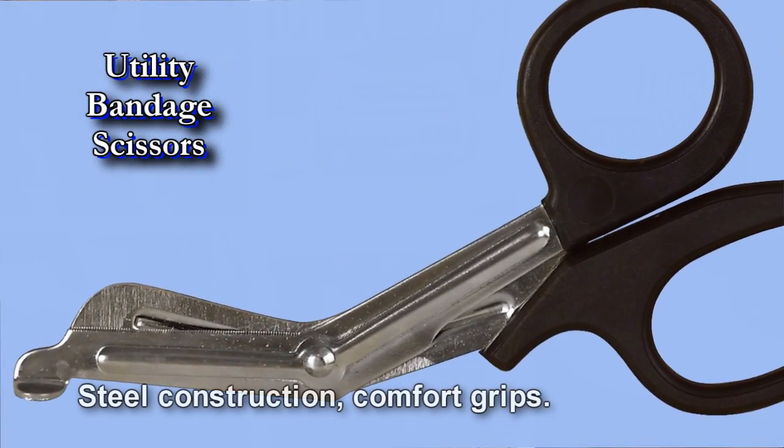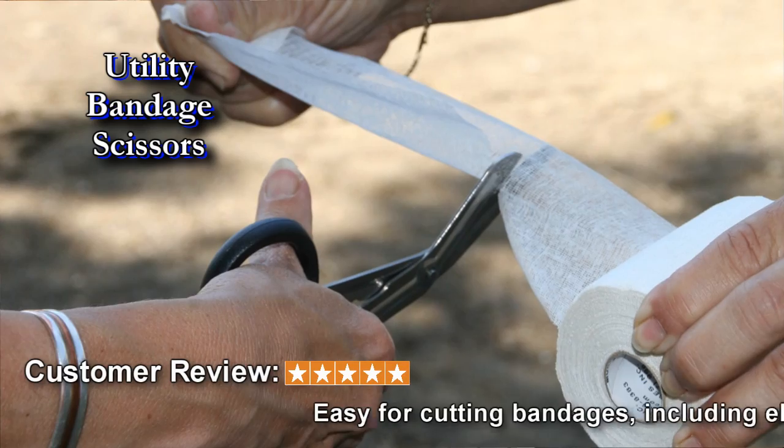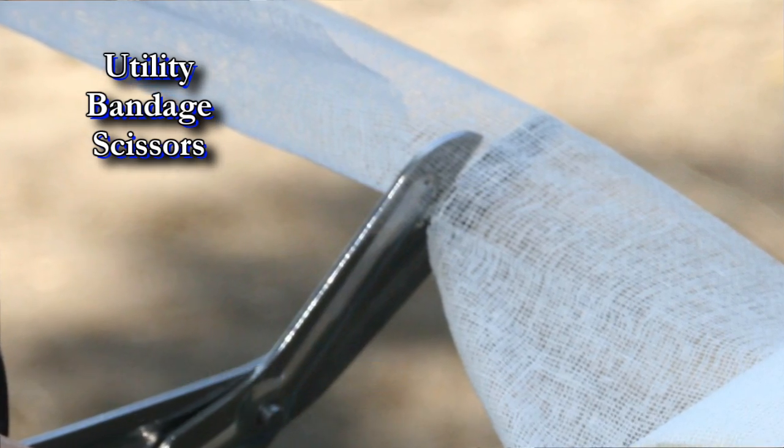Using utility bandage scissors is the safest and easiest way to remove bandages and wraps, especially from sensitive areas. The rounded tips glide safely along surfaces, cutting through the wrap without pricking the skin.